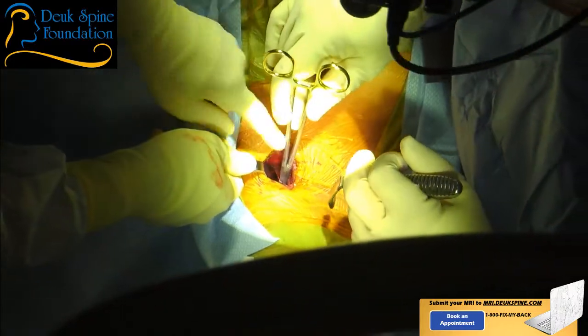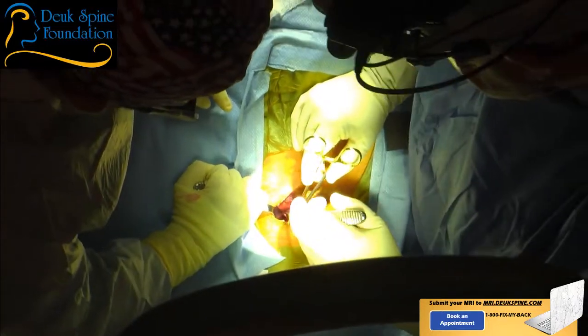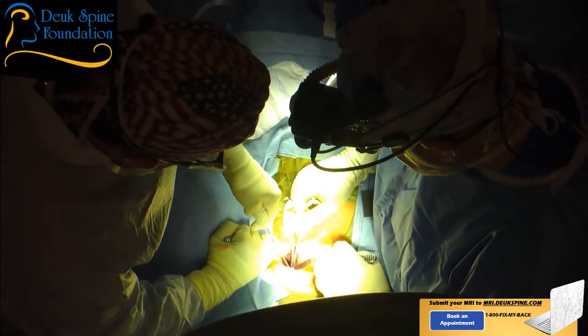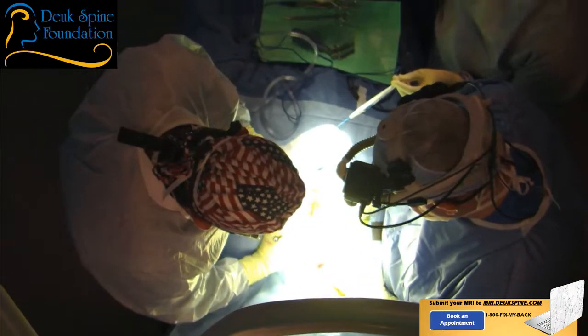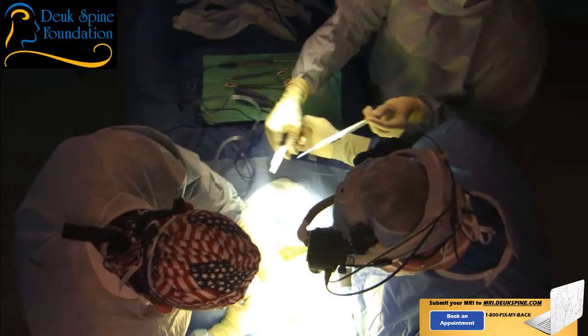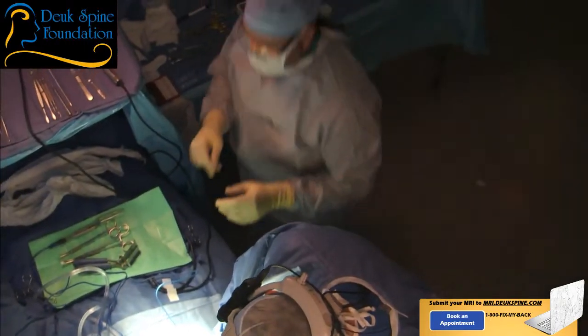Okay, let go. Okay, just get comfortable with your retractor. All right. So, sorry, Sean. I'll be back with you in a minute. We know that's 5-6 right there. So let's go south. There's 6-7. That's got to be 6-7 right there, okay? So out. And now I'm going to mark 6-7.